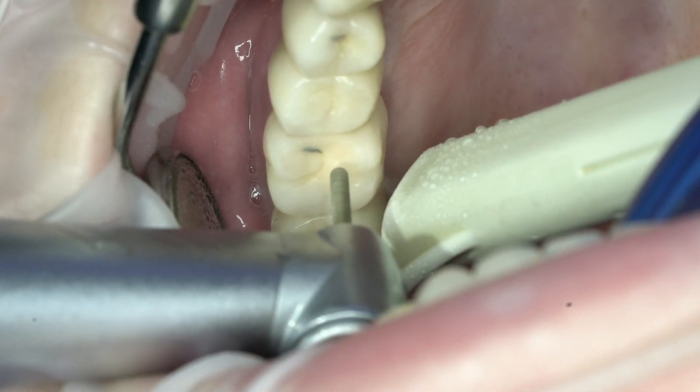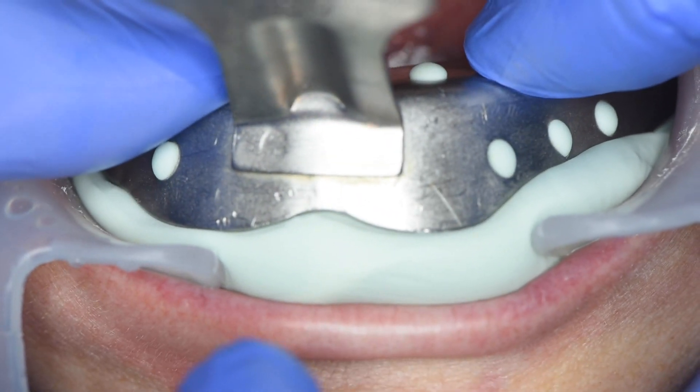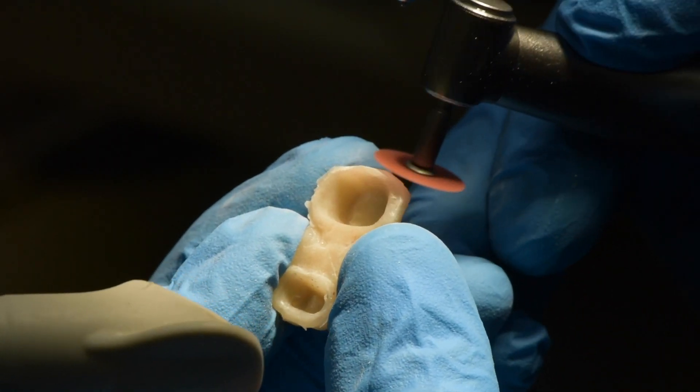The logical solution is to access the locking screw and unscrew it. First of all, you should make a silicone key. Then, even with a completely destroyed crown, you can make a temporary from resin.